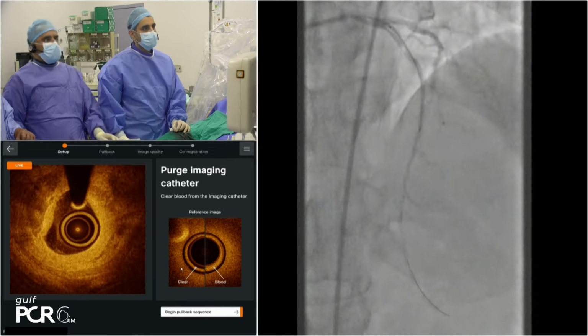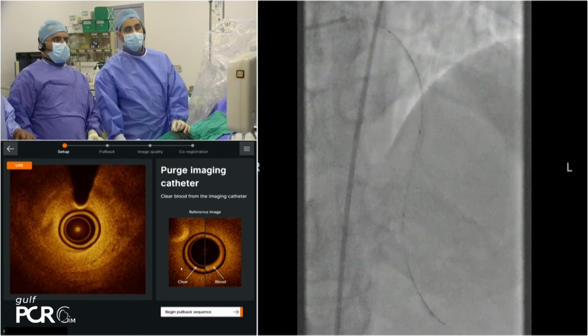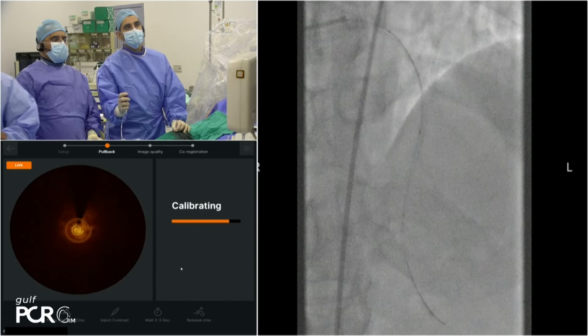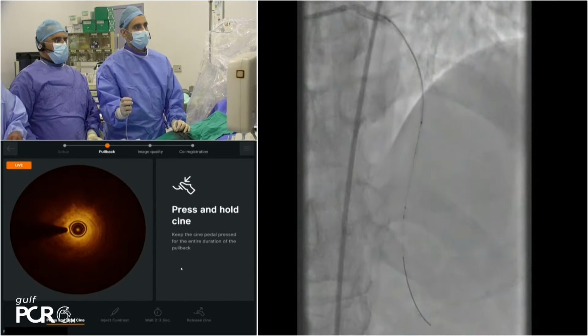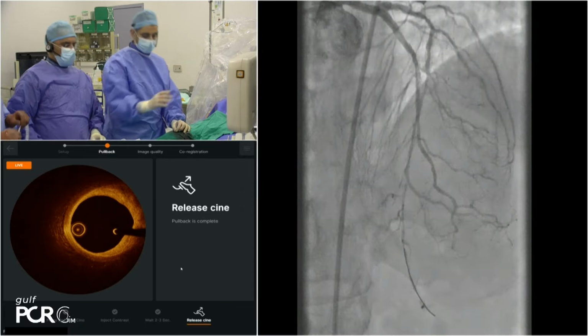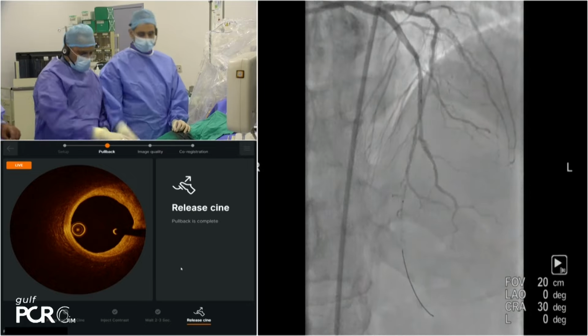Okay, ready? Tell me when you want to inject. Okay, cine, inject. Cine, inject. Okay, good. Take this out.